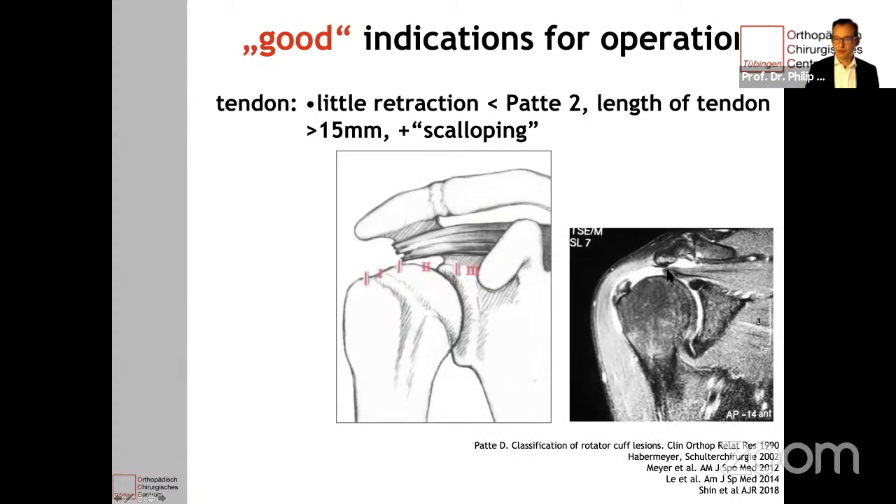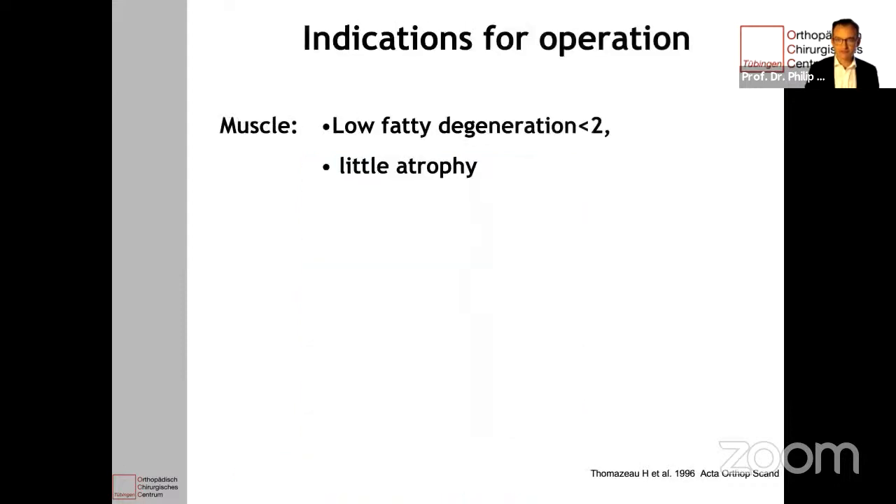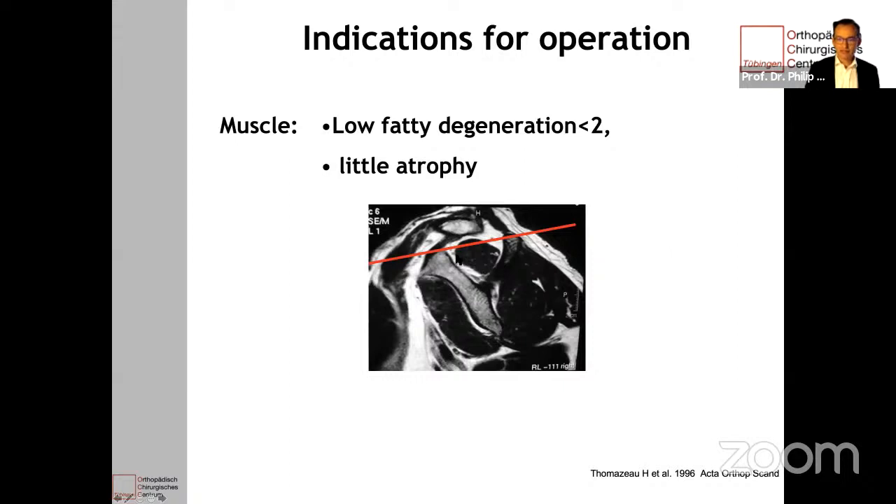In this case the tendon is pretty small and pretty retracted — so this is an indication that might not be too easy. An MRI is useful to decide whether the muscle still works, so I always order an MRI, or if that's not possible, a CT scan, to look whether there's fatty degeneration of the muscle. A healthy muscle looks like this in the T1 image in MRI, and if there's atrophy the muscle decreases and this tangent you can lay on the spine and the coracoid doesn't cut the muscle anymore — this is not a good sign.